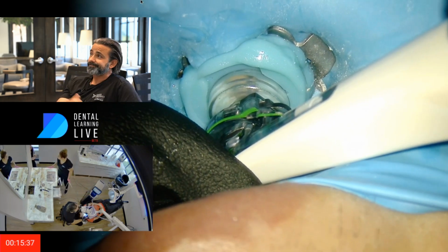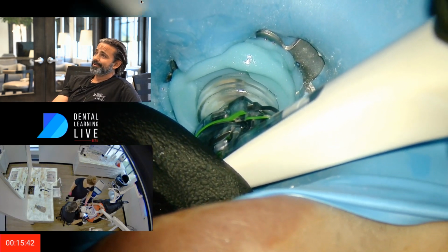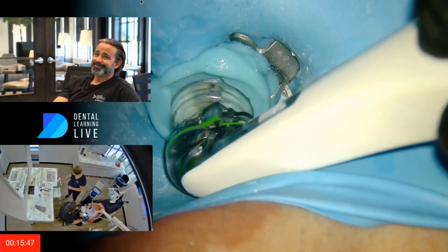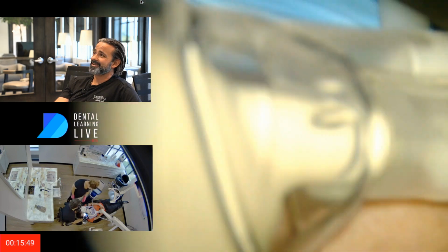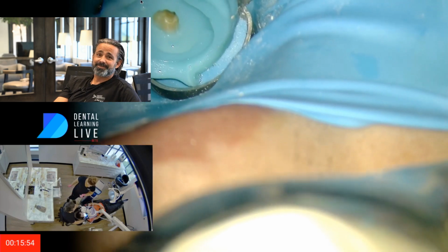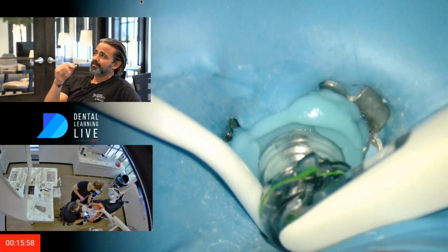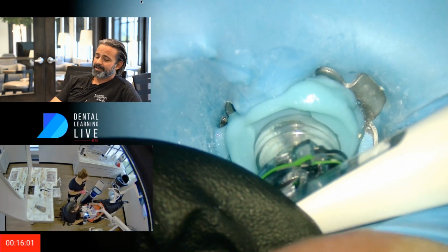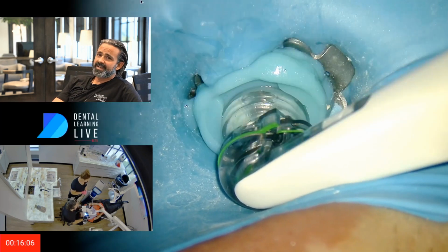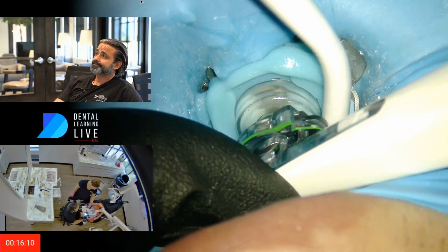And now it's just, in this case, dealing with the patient and watching him move. Just move. He just moves. We hate that, don't we? We're control freaks, aren't we? Look at that, all the way to his eyeballs. He blinded himself by looking in the microscope light. Okay, so get us back in focus and going again. Like I said, it doesn't change with the clock.